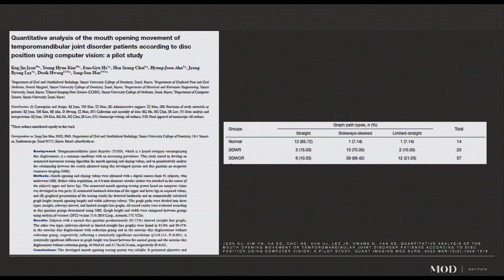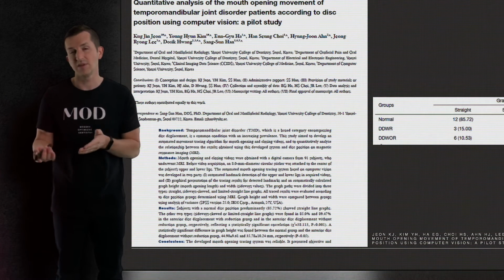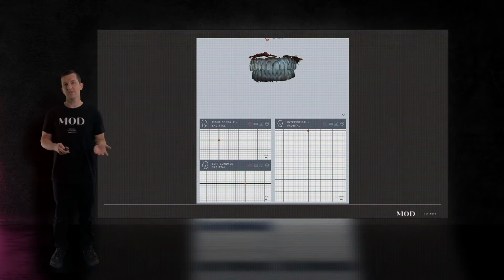So we're starting to build correlations where we can assess things in a more reachable way for our patients, because we all know that MRIs are both expensive and sometimes getting appointments can be really dragged out. And so it can certainly be out of the reach of some of our patients, but we still need a comprehensive way to understand the health of the joint before we start delivering any type of treatment for patients who may need to be stepped through the process a little bit differently than patients who don't have any type of joint dysfunction. And so sometimes it's very obvious, like in this patient.